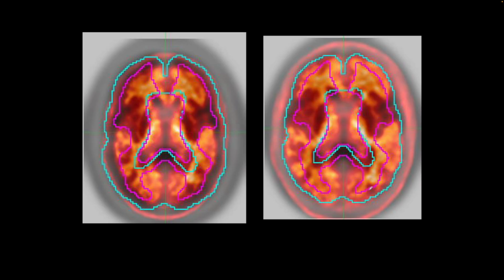And here is the significance of drawing the region of interest correctly. We are looking at images of one patient. They were initially evaluated by the software, the images on the left, where the blue line and the pink line, in between those lines, we want the cortex to be, but it didn't register correctly.